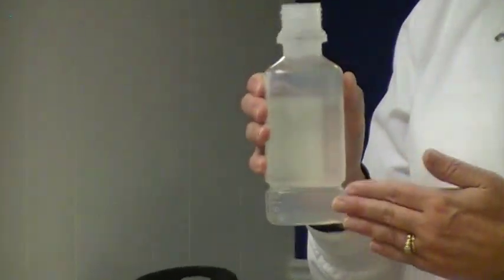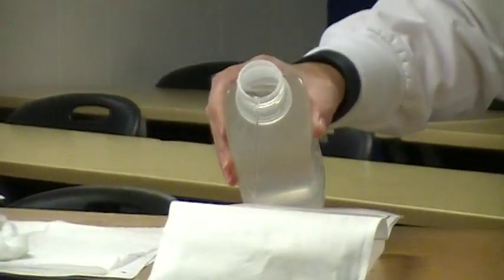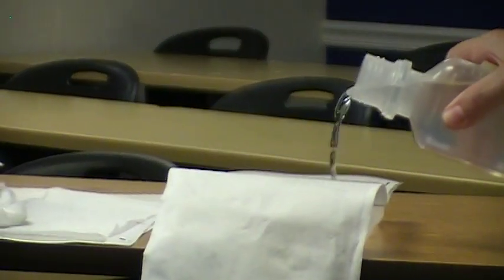Now again, the outside of this bottle is not sterile. So if I wanted into each container, pour. And again, you want to avoid splashing. Another principle of sterile technique is that if something sterile becomes wet, then we have to discard that because it's considered contaminated. I'm going to pour into our next one. And then thirdly, because I can't go over my sterile field because the bottle is contaminated, again, I'm going to move to the side, pour it that way.